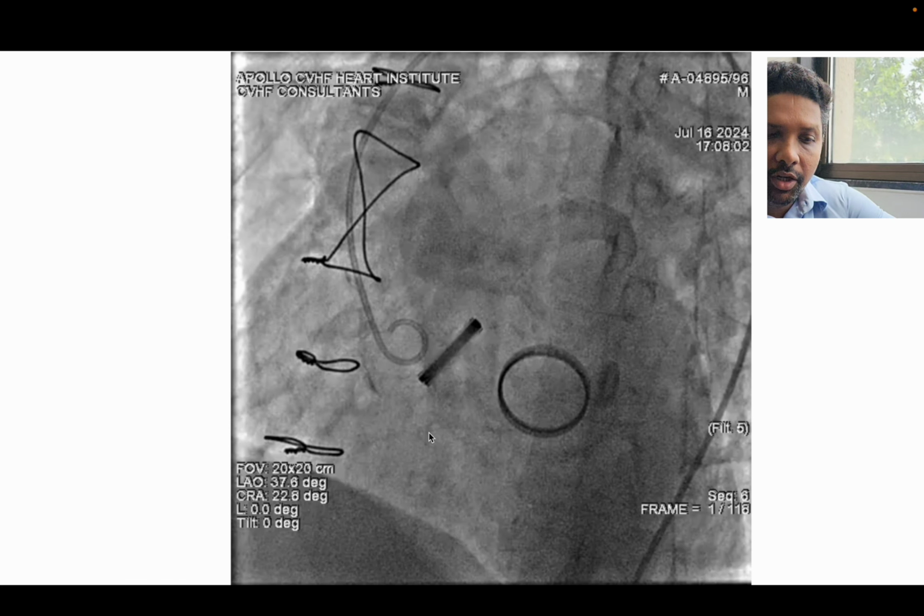and I positioned a Fubuki catheter. This catheter is a neurointerventional catheter, very supple catheter, very lubricious catheter. There are a few catheters which can be used and traditionally being used for paravalvular leak closure, like a Flexor sheath which comes from Cook company. It is also a very lubricious catheter, braided catheter, and it can enter very narrow paravalvular leak origins also. I found that Fubuki was very smooth to enter LV in whatever direction we have to push. Minimal push is required to get it into LV.